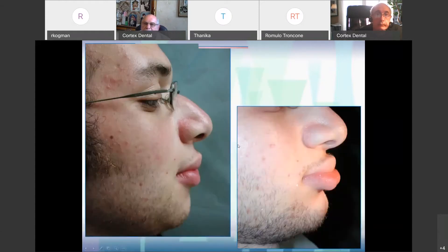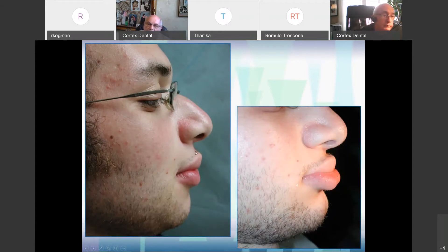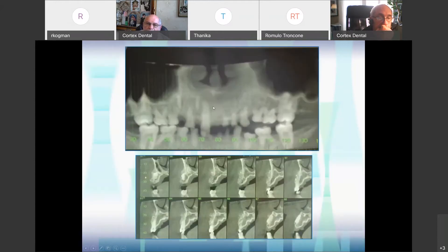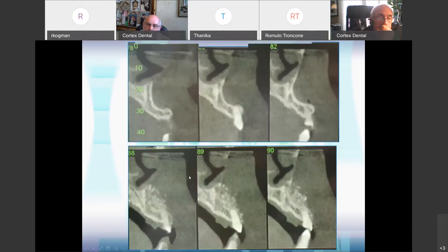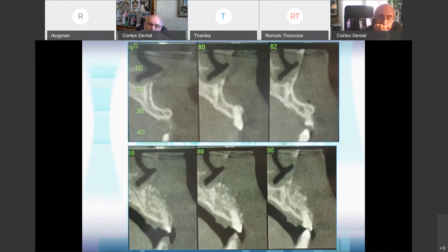You can see the difference only after filling the depression of the vestibulum, the shape of the lips, compared to what we started with. We started getting a normal profile. We started with this, and you can see here the two wedges that I made — the compartments — wedged into the bone. This is the left side. Without the wedges, bone is less calcified.